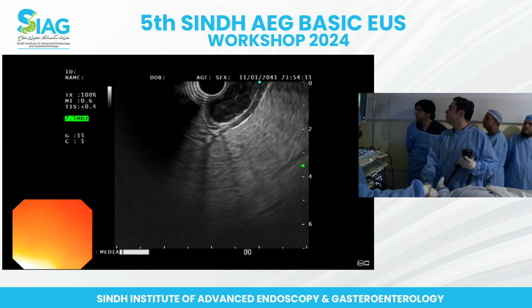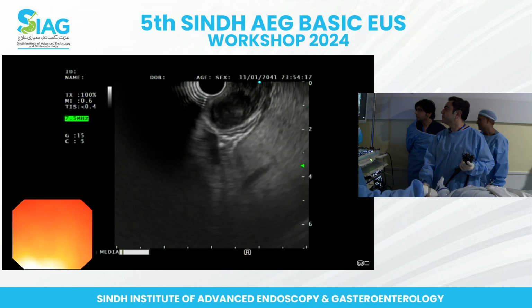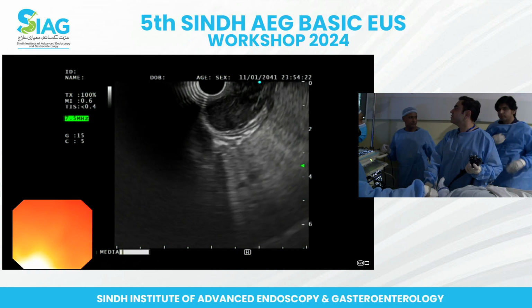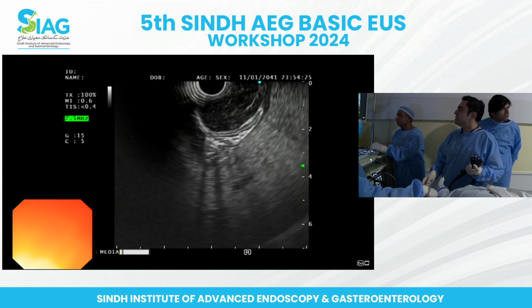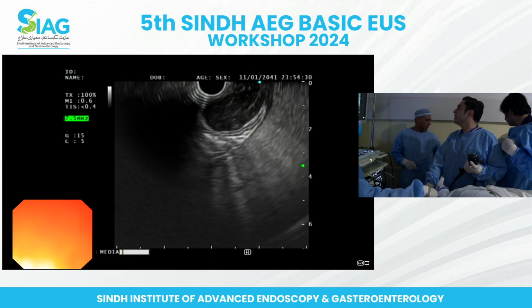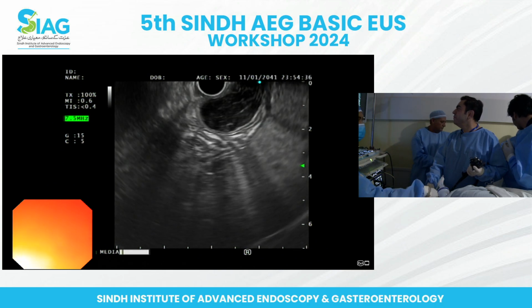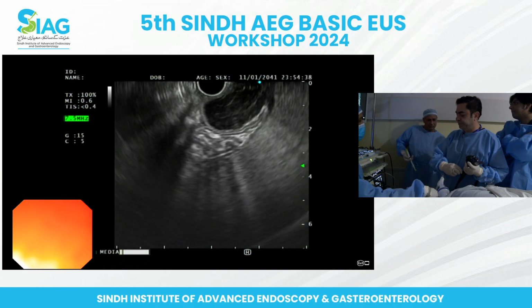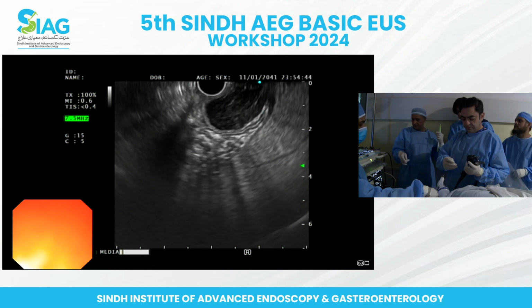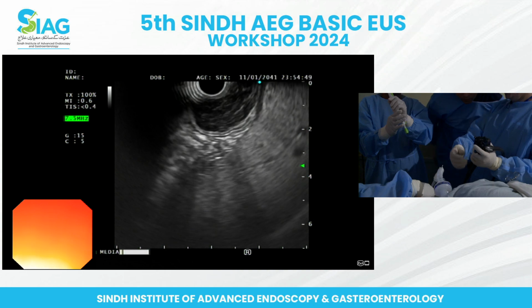Okay, can we have a 22 FNB? Excellent. Once we've done the sample, we'll go to the D1 then. It's okay to stick a needle in even when there's a question. You can do FNA even for a duplication cyst. If you see thick debris and no major cells under the microscope, then it's likely a duplication cyst, which can have really thick debris. So we just open it and push the needle in.